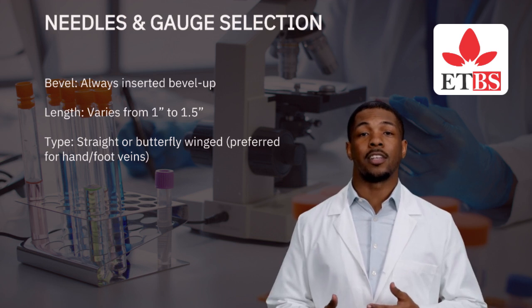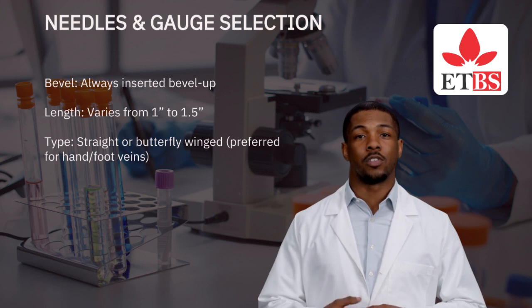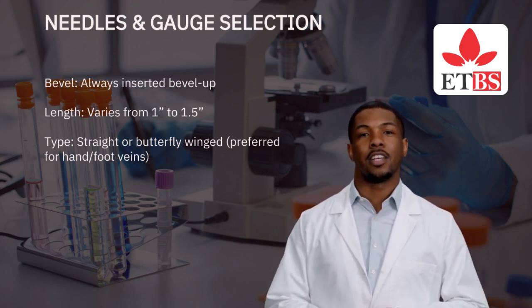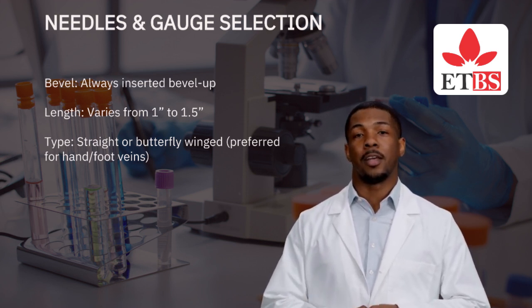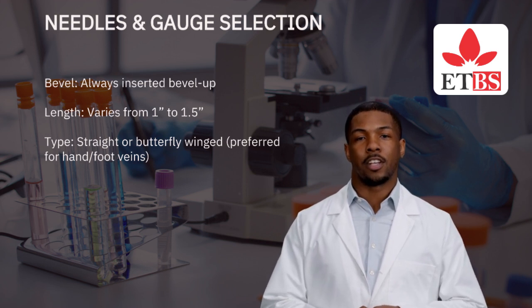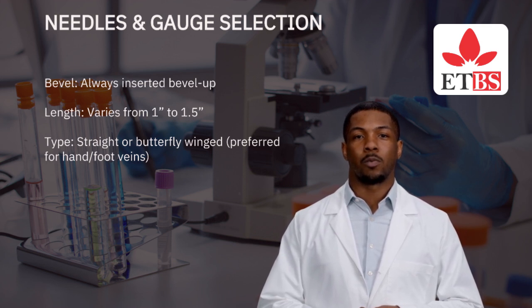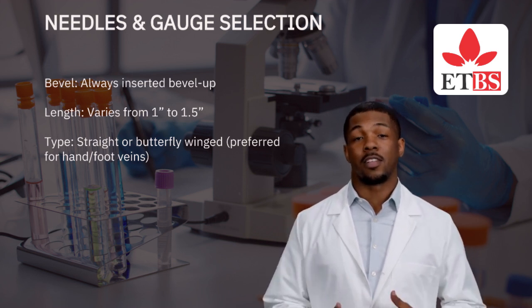4.2 Needles and gauge selection. Needles are color-coded based on gauge size, which refers to diameter. Gauge, color, use case: 21G, green, standard adult venipuncture; 22G, black, smaller veins, pediatric, geriatric; 23G, blue, fragile, superficial veins, butterfly; 25G, orange, pediatric or small veins, capillary. Important features: bevel, always inserted bevel up. Length varies from 1 to 1.5 inches. Type, straight or butterfly winged, preferred for hand and foot veins.